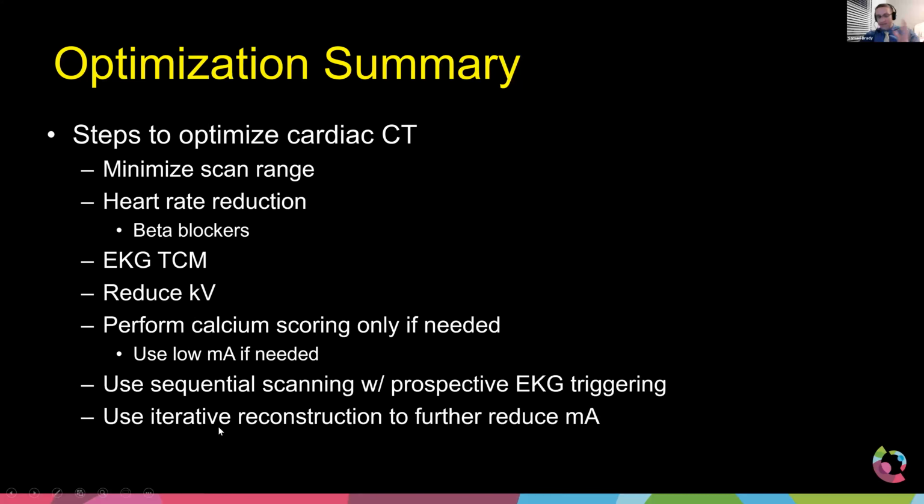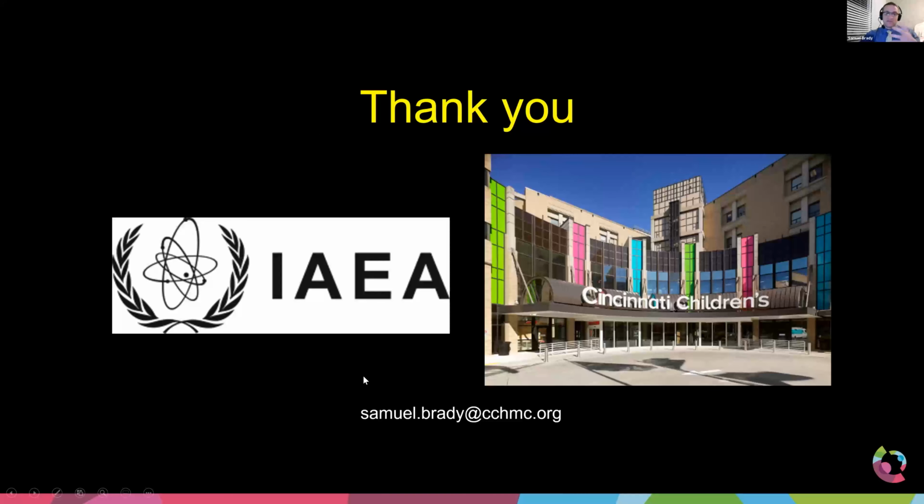That said, I will be the first to admit when you use iterative reconstruction, it does fundamentally change the type of image, the texture, of course, and it can soften the edges in the image. I showed you this last week. So there may even be some doctors out there that just can't look at an iterative reconstructed image in the heart and feel that that's appropriate, because it softened the image a little too much.